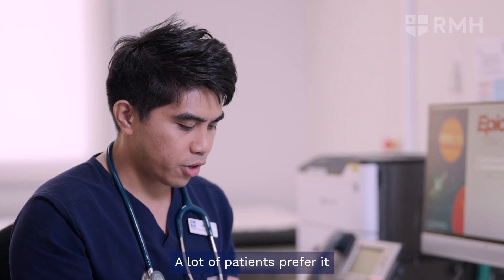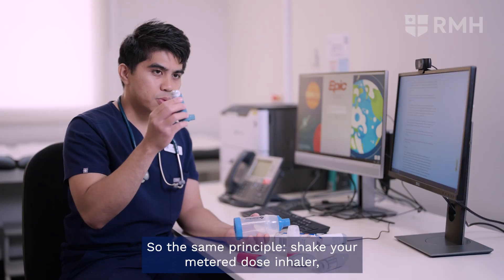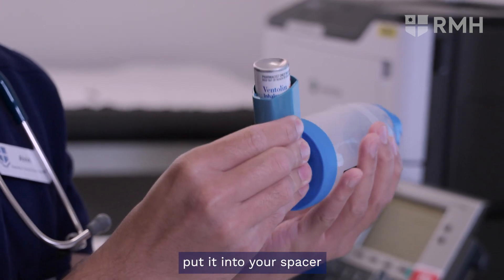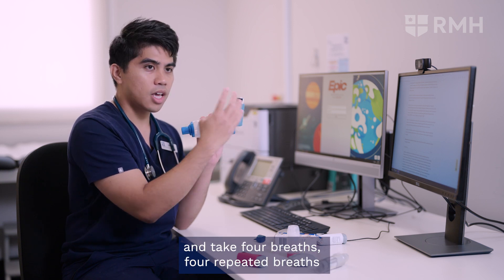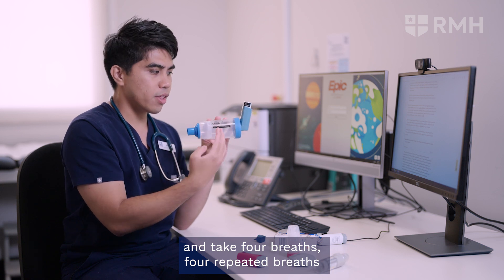A lot of patients prefer the spacer because they feel like they're getting more of the drug. So the same principle: shake your metered dose inhaler, put it into your spacer, and then press the canister and take four breaths. Four repeated breaths, and that's one dose.